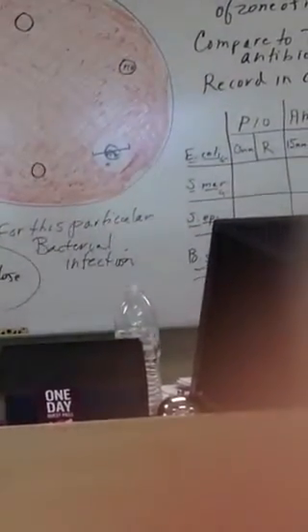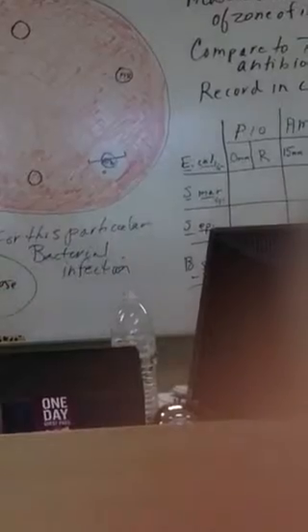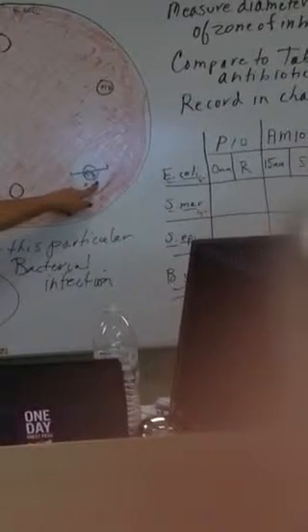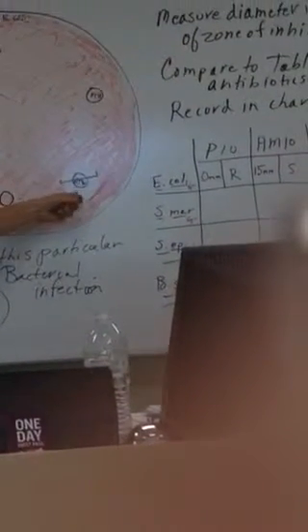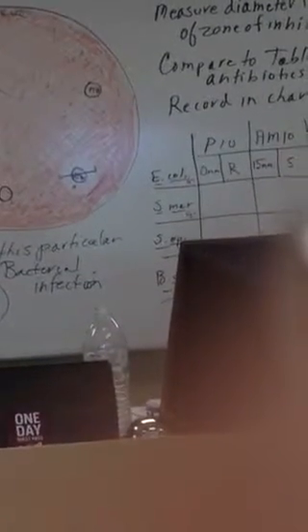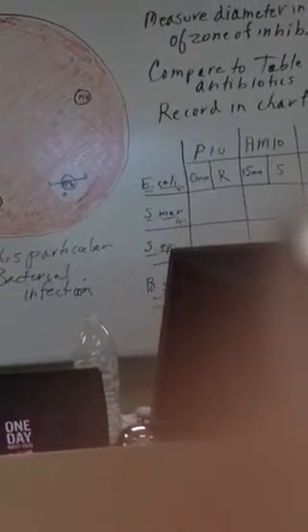So usually what they'll do is add another antibiotic. They don't want to withdraw the first one because it's actually working for most of the infection. But now I've got to find another drug that will get these resistant ones. So there's different things they can do with a Kirby-Bauer test, but it's not the end all for selecting an antibiotic. There's other things that have to be considered.